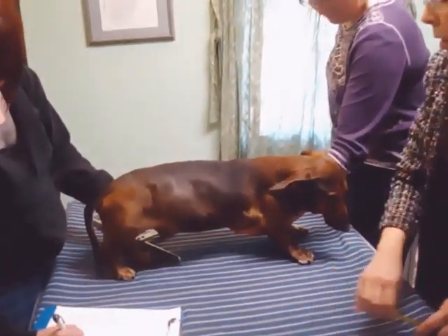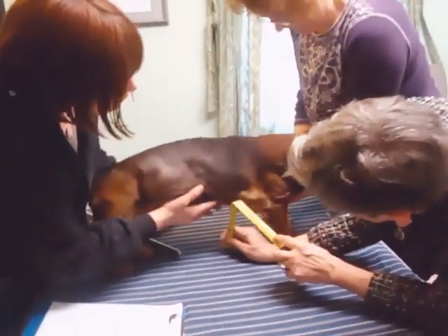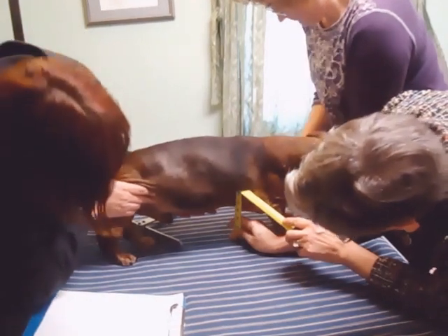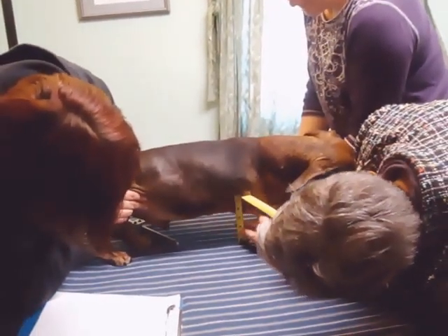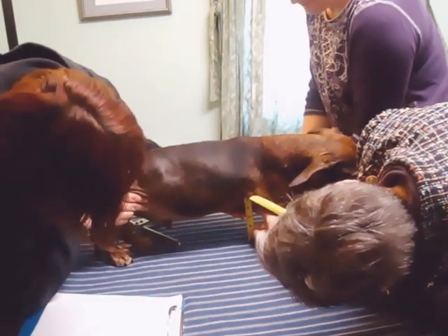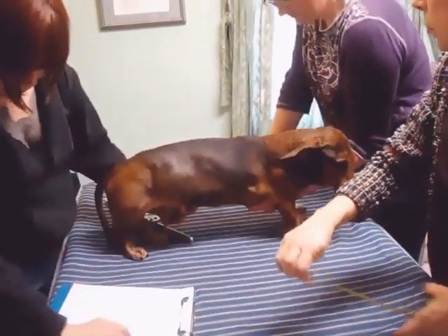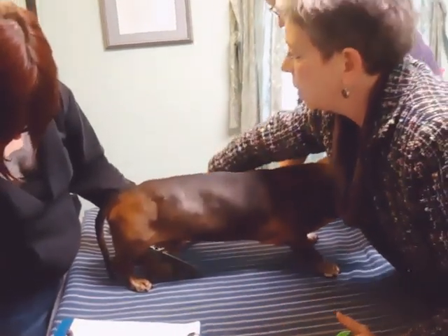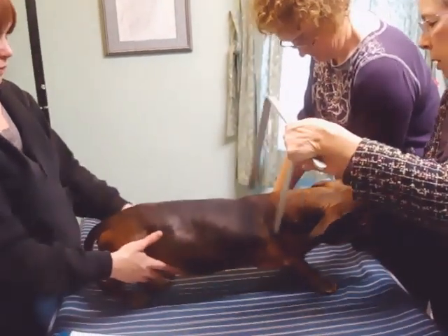And then H — we need to get them up a little more in the front. There's a fatty lipoma here I want to take into account, so I'm saying three and a half. Always take into account any fatty lipomas and bumps and include them in your measurements.